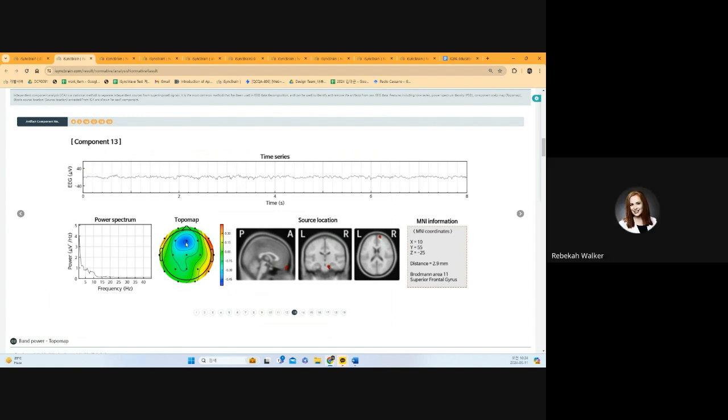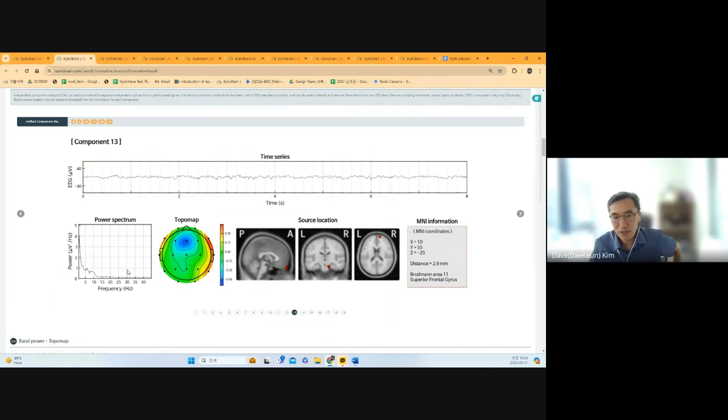Okay. Yeah. And then could they also do the right temporal if they wanted to target the right temporal for this particular case? Yes, right. Okay, got it. Yes, if they want the right temporal area, then they can target the right temporal.